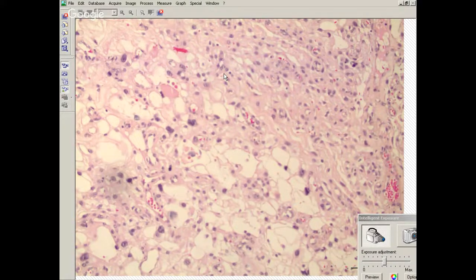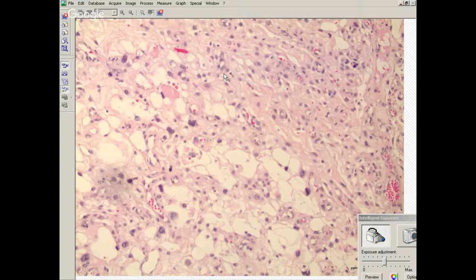What I showed you before was the classic hyalinized blood vessels, but it had the typical meningioma appearance. This is an angiomatous meningioma, where you have the typical features, including degenerative nuclear atypia. But it still is a grade 1 and it doesn't behave any worse than any other garden variety grade 1 meningioma. Okay? So knowing that is helpful because you don't want to overcall it.